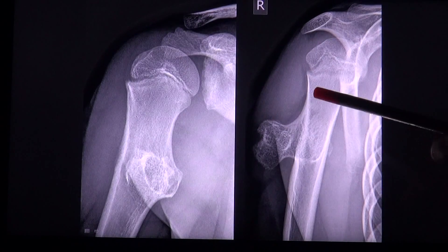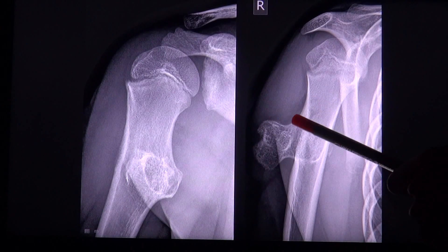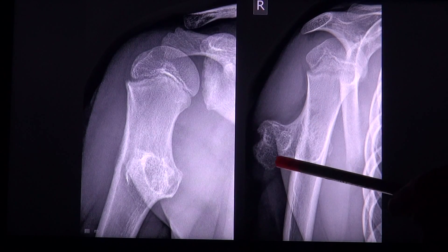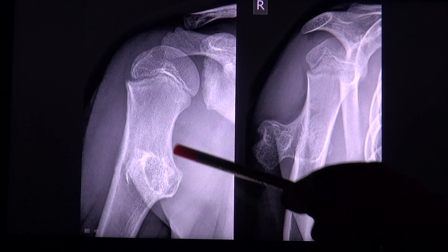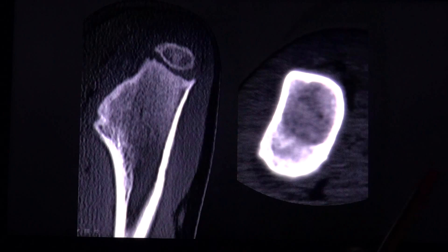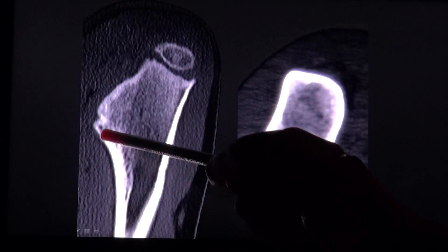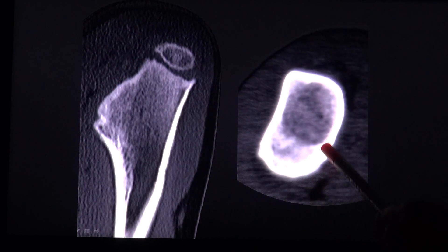Here is another example. You can see the continuous cortex to this lesion. Here you have a CT scan where this can again be very well seen.